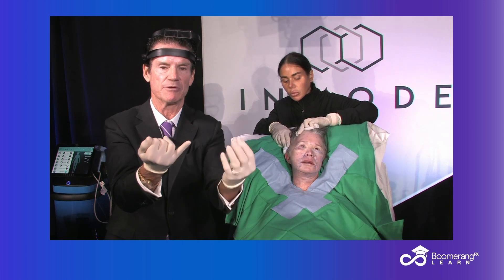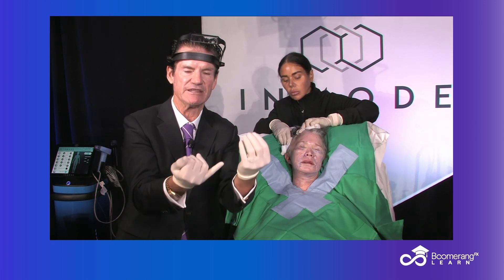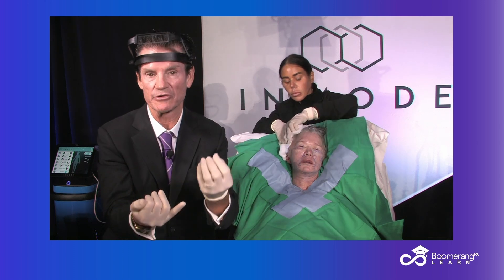Phase one, we did injectable RF, undermine, liquefied the fat, tightened the FSN. Now we've got the melted cheese of our grilled cheese lift.